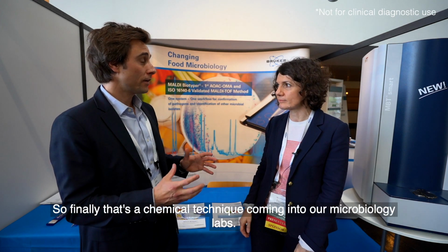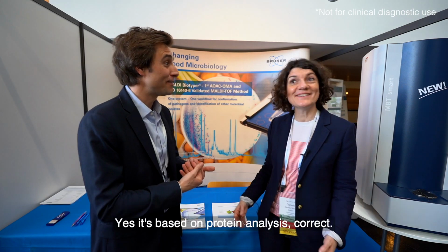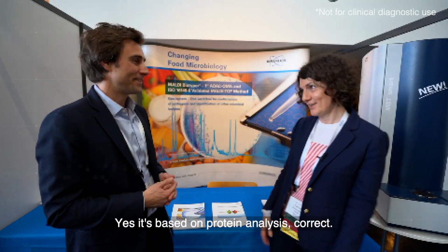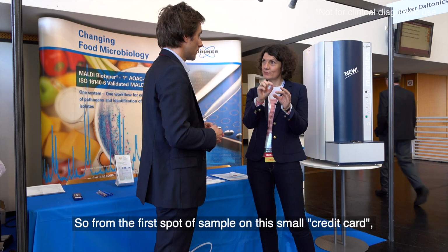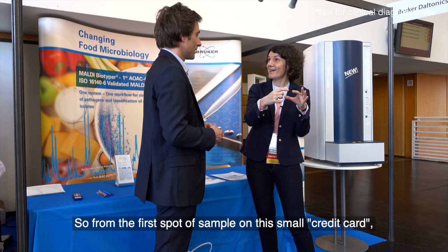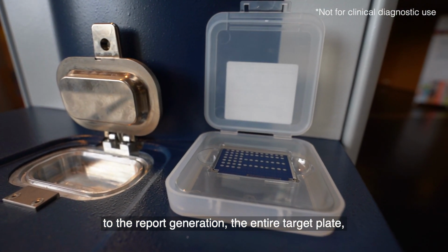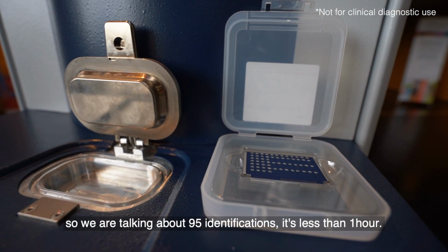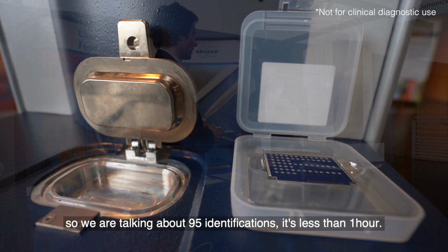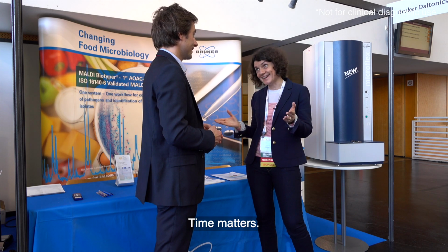So finally that's a chemical technique coming directly to our microbiology lab. It's based on protein analysis, correct. From the first spot of sample on this small credit card to the report generation, for the entire target plate, so we are talking about 96 identifications, it's less than 1 hour. Wow. Time matters, huh? Yes, sure.